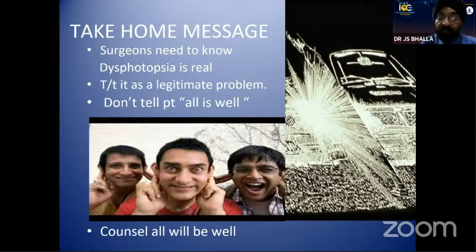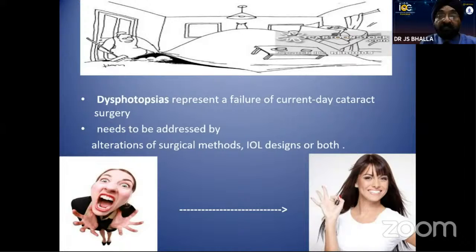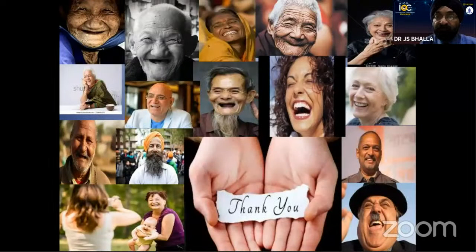Yes, you can counsel the patient that all will be well. Dysphotopsias represent a failure of current-day cataract surgery and need to be addressed by alteration of surgical methods, IOL designs, or both. If we are able to remove these haunting images from the field of vision of these patients, then the smile will return to the countenance of these distressed souls. Thank you everyone for your kind and patient hearing.